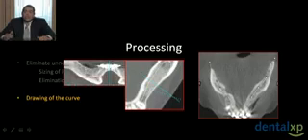Because here's what happens in this case. We see that at each position or each point of each of these cross-sectional images, the path of that processing curve is at a different orientation, and although it's parallel to the buccal cortical plates, it will cause the cross-sectional images to actually converge on each other.